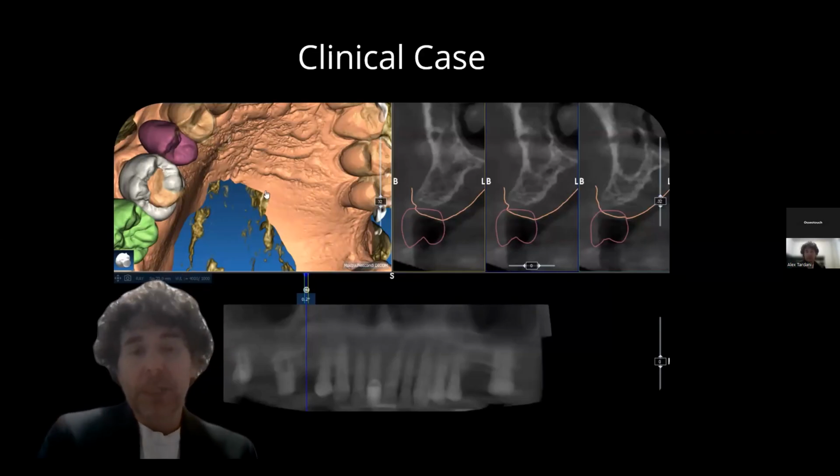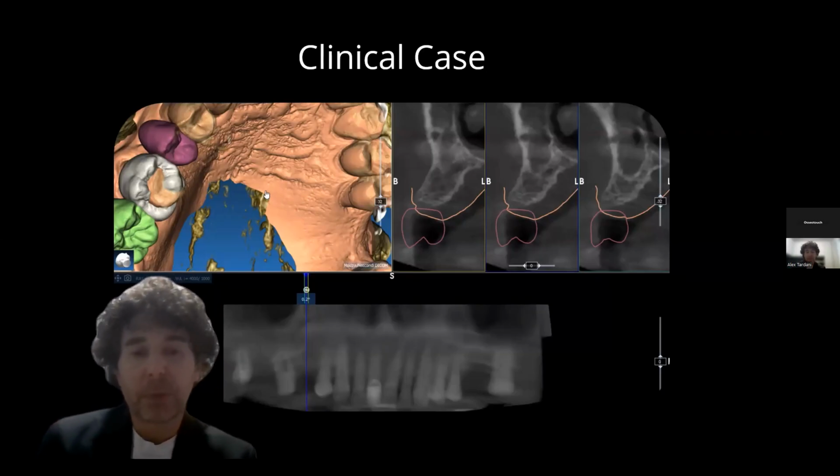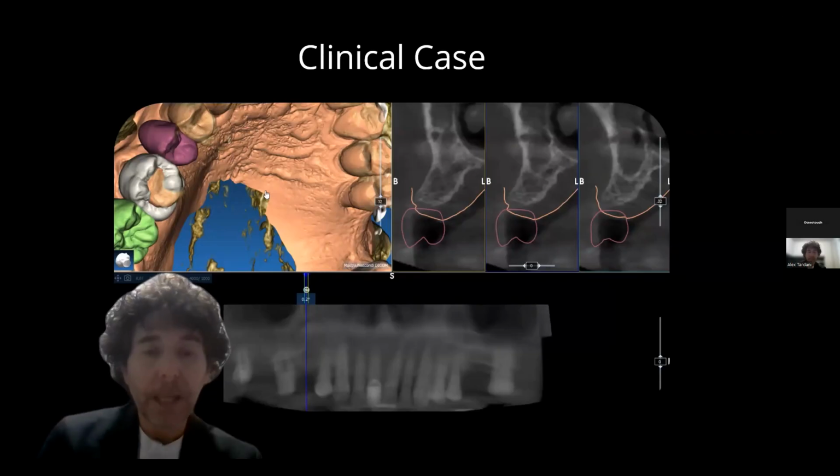So, what was the situation? We had a patient with a bridge, supported by a third molar and a first molar, both periodontally compromised, and in a patient who absolutely did not want to be left without teeth. So we evaluated placing 2 implants in the 5 and 7 positions, temporarily keeping the 2 clinically hopeless teeth to allow the patient to chew.